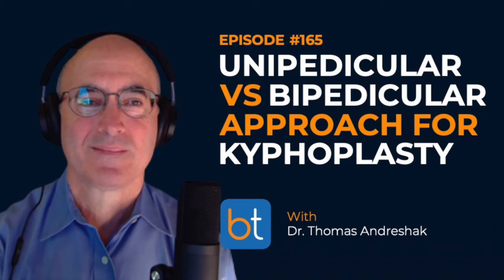In the beginning, the fill was important. We used to fill a 3 cc balloon. You only fill 3 cc's. Early studies in the early 2000s showed that if we don't get the bone interdigitating between the compacted bone, you lose your endplate. So you collapse a little bit, lose your reduction or your height. The trend then was to go to a fuller fill, bigger balloons, and maximize the fill. In terms of orthopedics, we always say it's about the reduction. So force equals pressure times area.